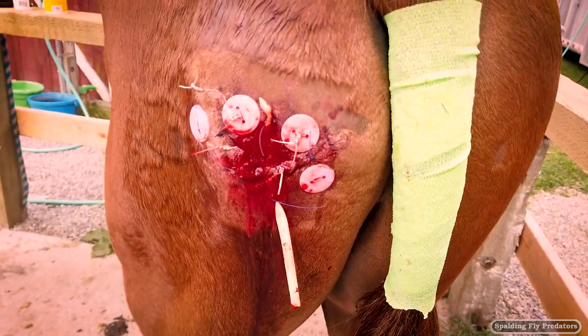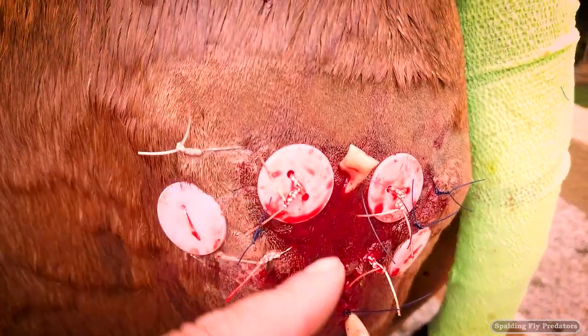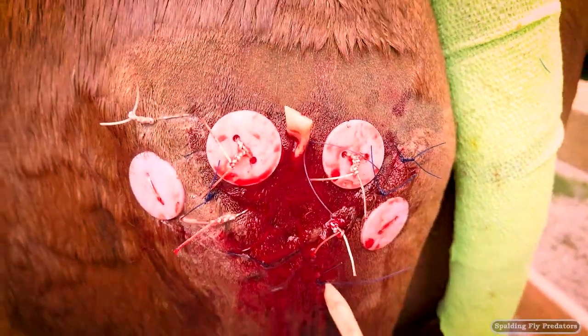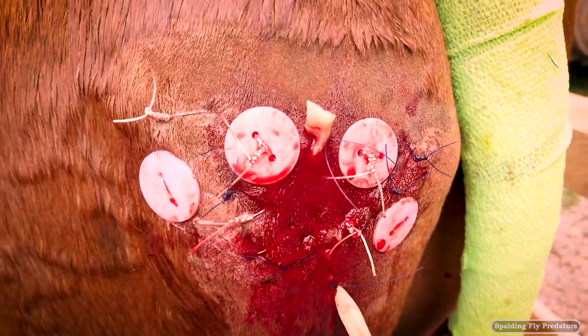This is the final result. We've got two tension-relieving sutures here and here, plus the drain. He ended up with a total of seven sutures plus the buttons and drain.